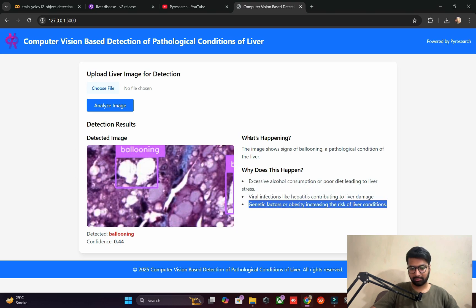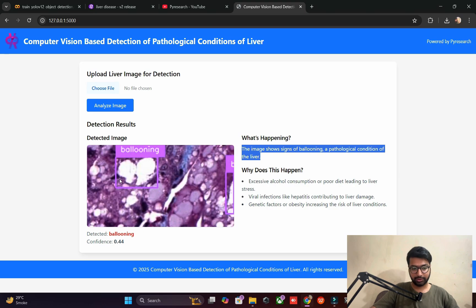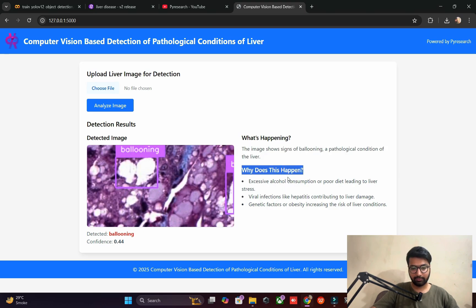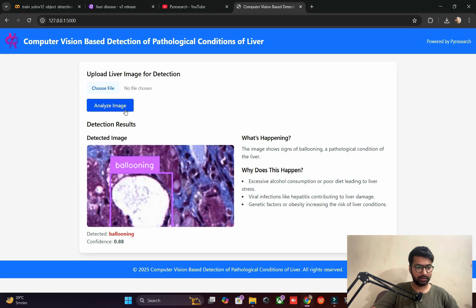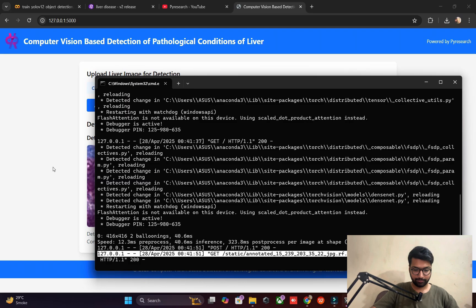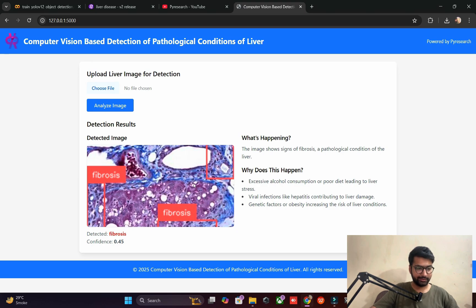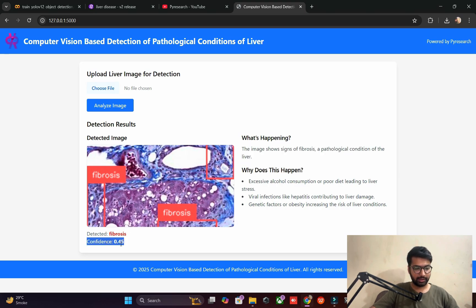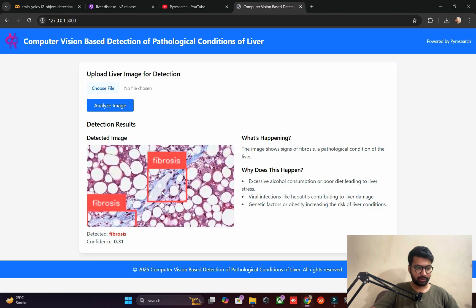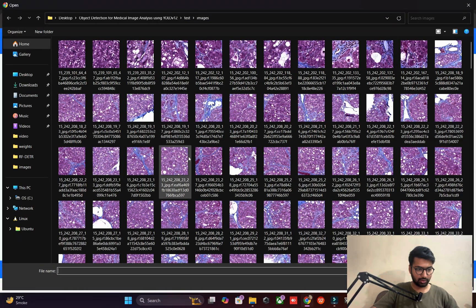This image shows ballooning detected as a pathological condition of the liver. Let me check another picture. I upload another image and analyze it — it detects fibrosis. Why does this happen? Our model is working at 40 percent confidence here, and another result shows 30 percent. Also inflammation is detected in another image. Let me close this and open CMD again to look at the code.